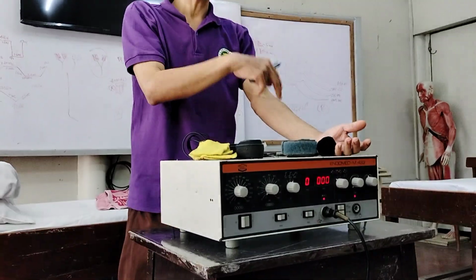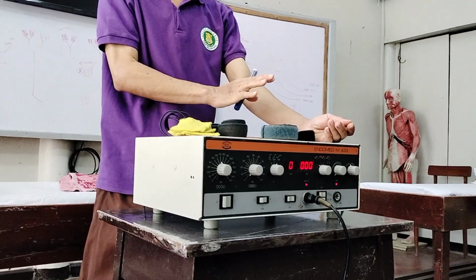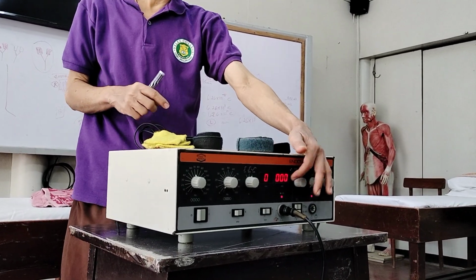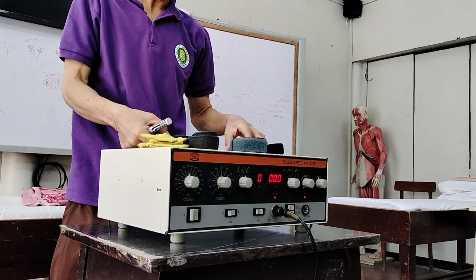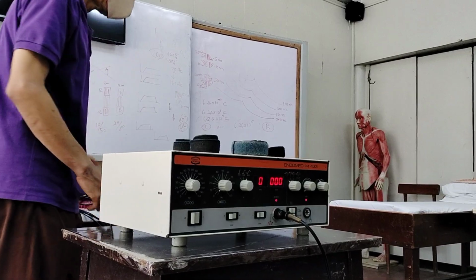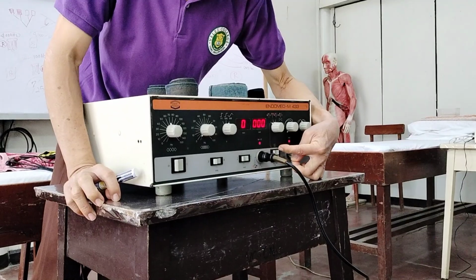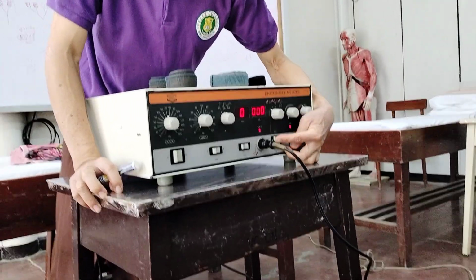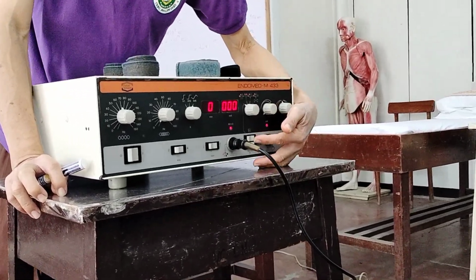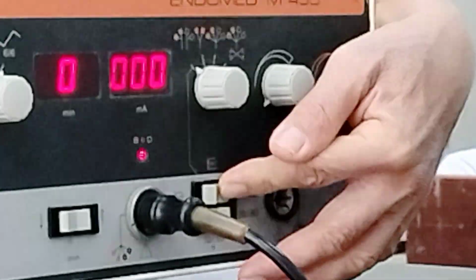So you do not cross them, for the reason that this is a bipolar technique, or 2-pole, for muscle stimulation. The illustration separates them. Clear? Okay. So, once you choose here, you can now see a line going further down. So, you have to adjust this one. There are selector switches there.